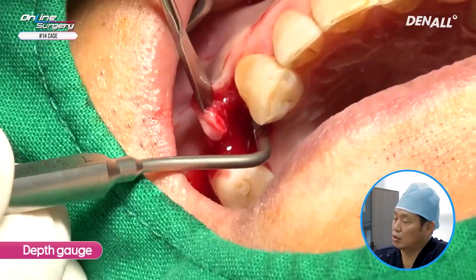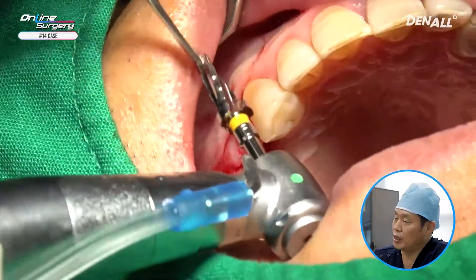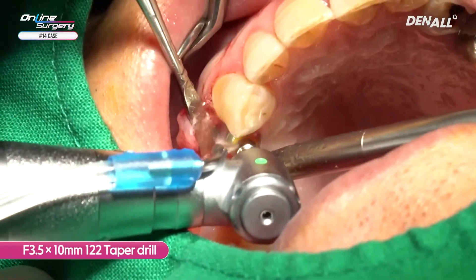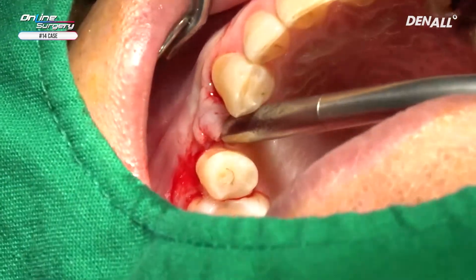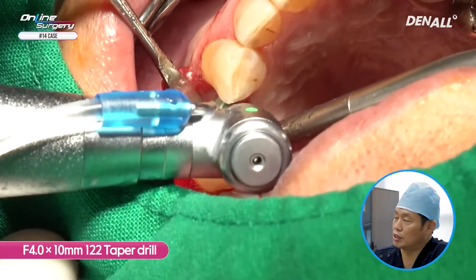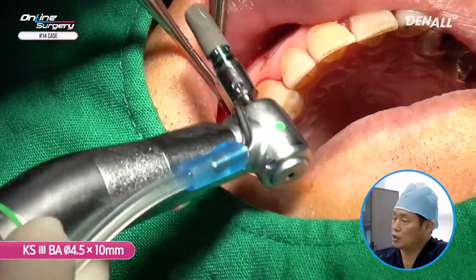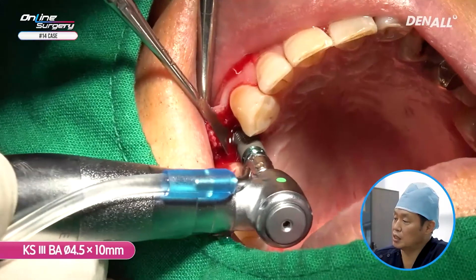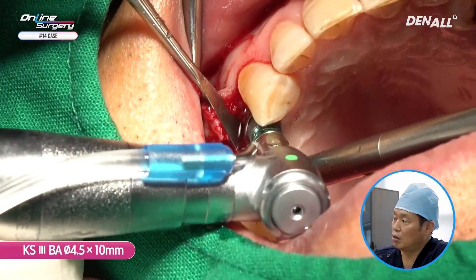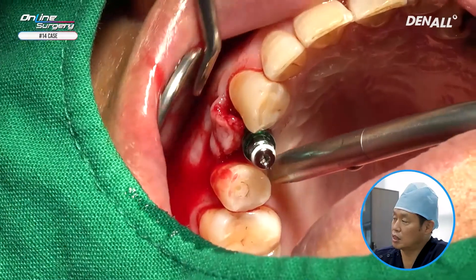A depth gauge is used to check for perforation or fenestration on the apex side. After that, a 3.5 by 10 mm, 1.2, 2.2 taper drill is used. A 4.0, 1.2, 2.2 taper drill is used for the final drill. The original plan was to place a 4.5 by 10 mm implant — KS-3 BA surface, diameter 4.5 by 10 mm. The implant is being placed; this is a hydrophilic implant so you need to sufficiently irrigate it with saline.